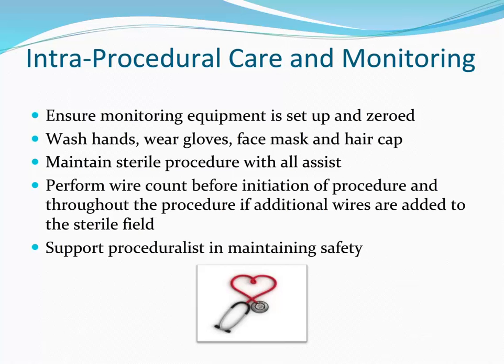If the proceduralist is having trouble obtaining access, please advocate for your patient's safety, working together to identify a more experienced provider who can assist with the line placement. Research has shown that when a provider goes beyond 2 attempts at placing central access, the risk of complication increases 8-fold. We work in a teaching environment, and it is not uncommon to have relatively inexperienced providers performing these procedures.